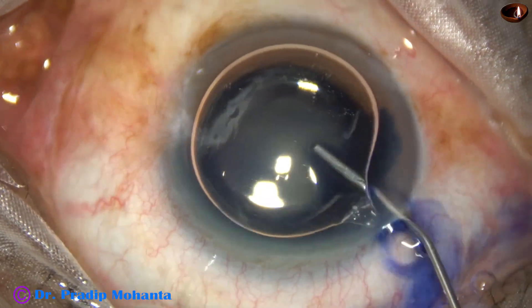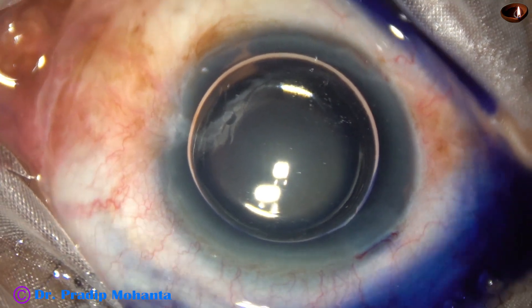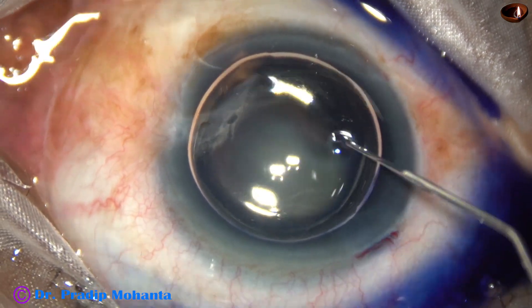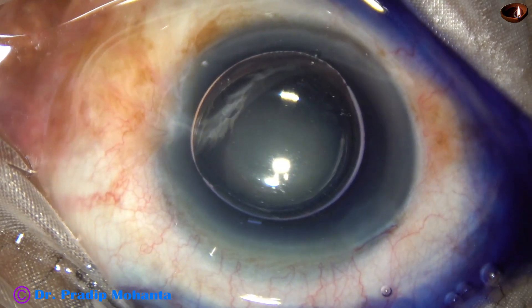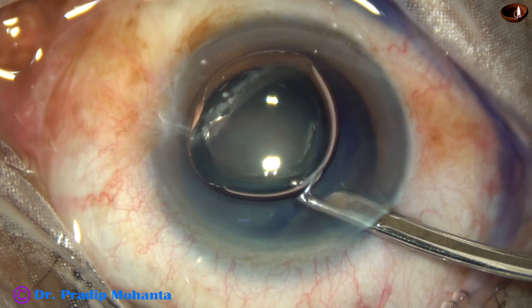After injecting an air bubble, trypan blue dye is applied over the ocular surface. This is a bit of adrenalin. And now the dye is washed out.